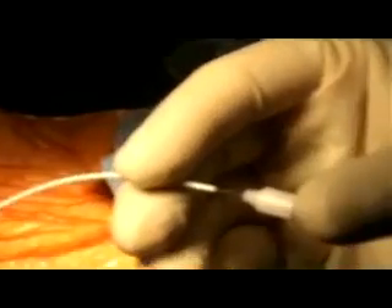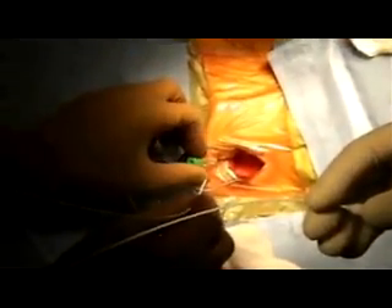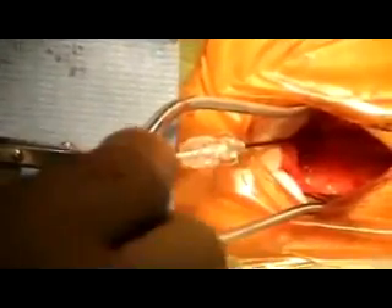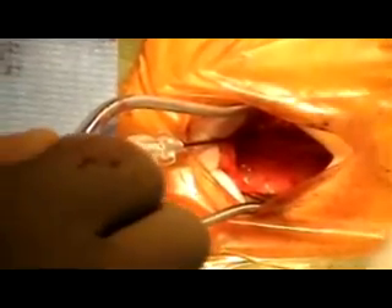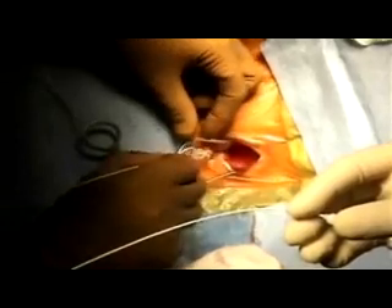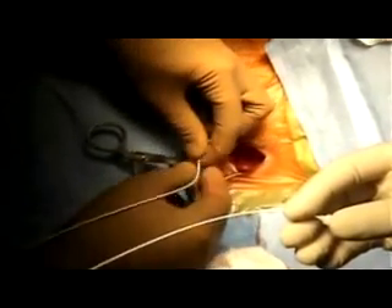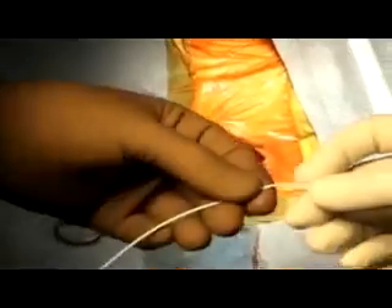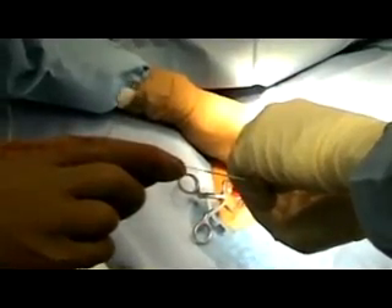The lumbar incision is made to expose the fascia. A paramedian approach is used for the lumbar puncture, and an adequate length of catheter is advanced into the intrathecal space. The placement of the catheter is confirmed by fluoroscopy or x-ray. Satisfactory backflow of CSF through the catheter is ascertained before and after anchoring it to the fascia.